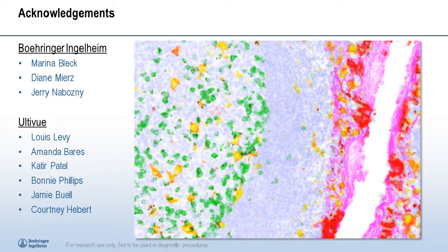This is a good question. They're obviously paying attention. If the primary antibodies can be swapped out, PD1 combined with PDL1 kits, how do you get specific fluor binding when you combine the two kits in one assay for the 7-target, 8-color assay? The commercial kits were initially produced with similar barcodes. When we worked with Ultivue for that exchange reaction, they had to relabel one of the kits with unique barcodes. I'll have to defer to Ultivue on how this is going forward, but my impression is that they will start putting unique barcodes on all of the antibodies.